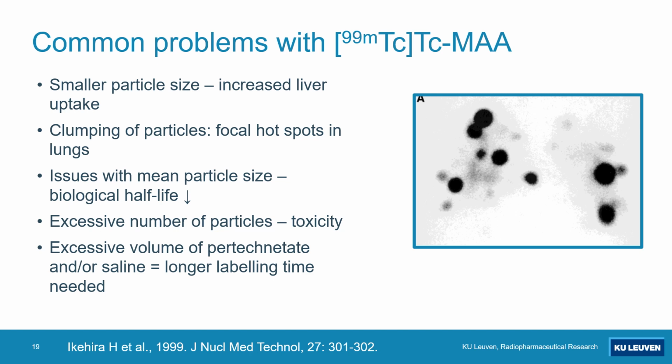So always remember you have to adhere to the instructions of the volume of technetium and the concentration of the activity added, so that you don't endanger your patient by injecting too many particles.